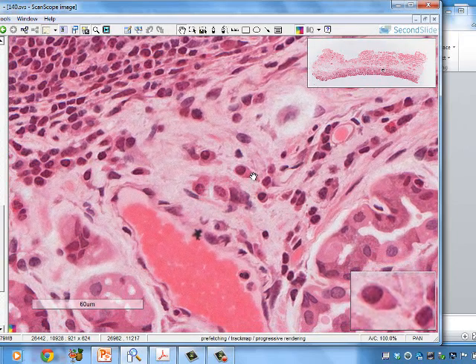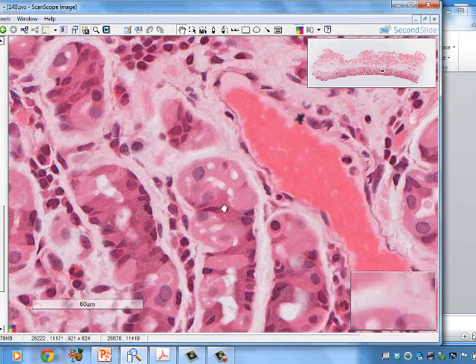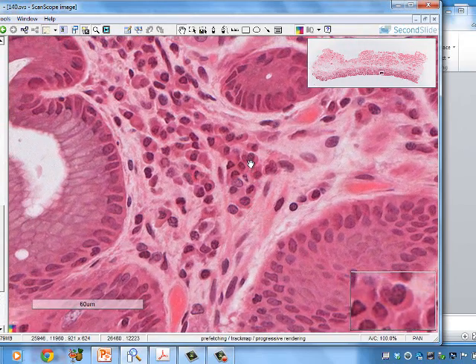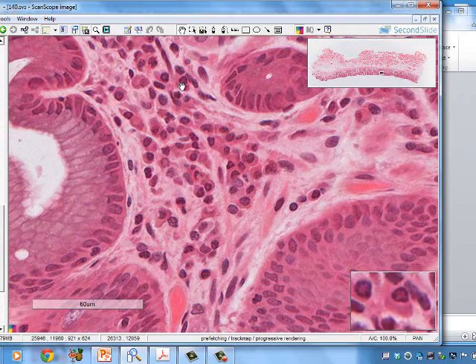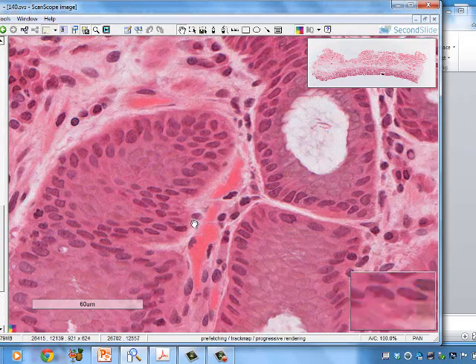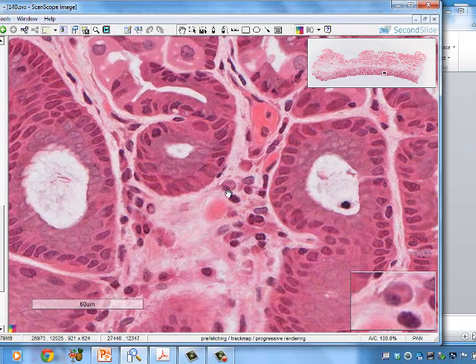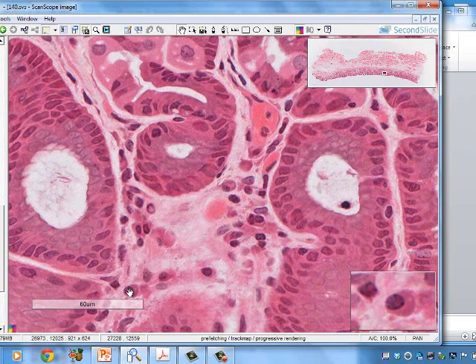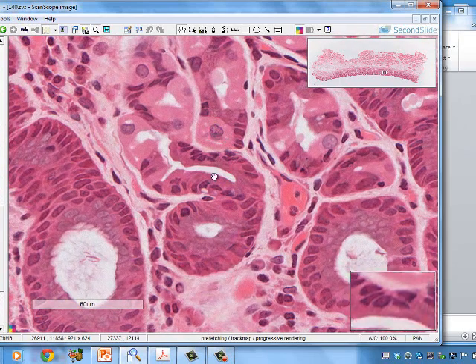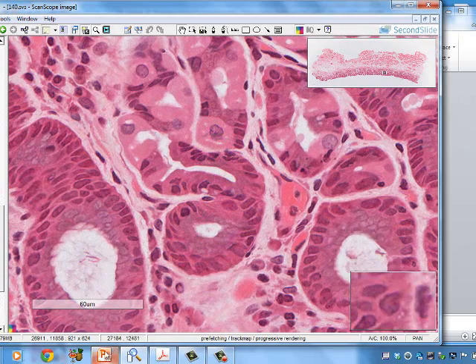A lot of cytoplasm associated with another cell in through there, and you can see the different cells. Plasma cell here, and here, and here. There are a host of plasma cells producing antibodies associated with this infection. Very classical plasma cell right there and right there. This is in the stomach. These are parietal cells and chief cells in the stomach.